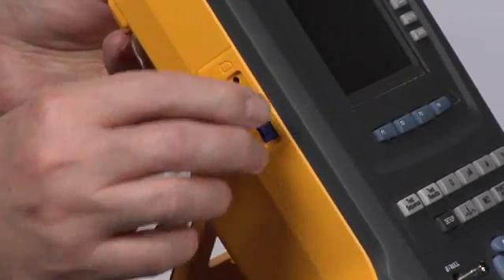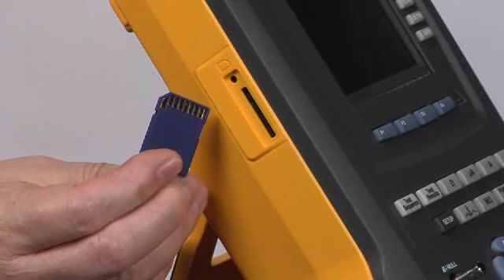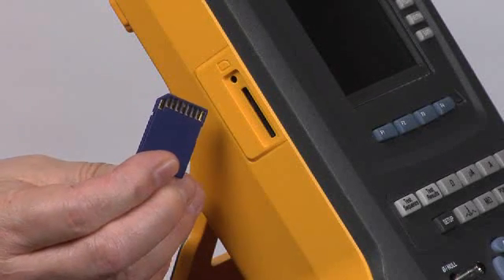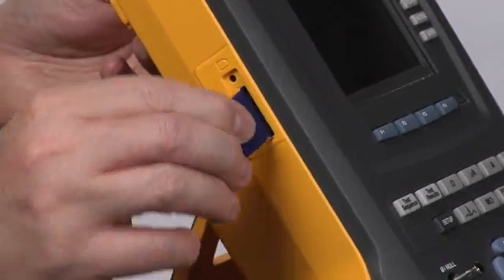The SD card pops out very easily and can connect to an SD reader connected to your computer for transferring files.